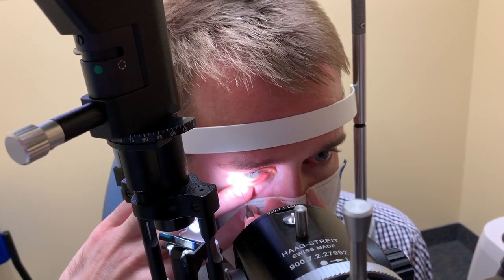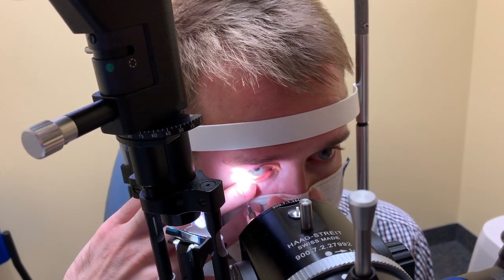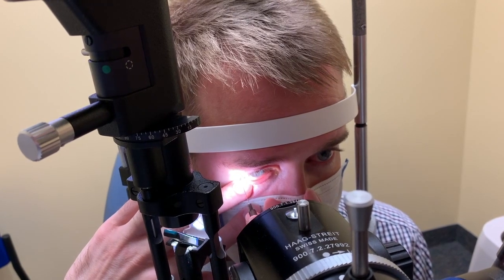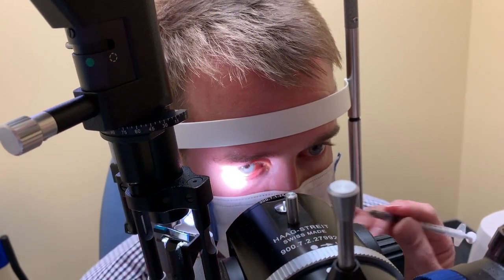There is another way to numb the lids with a lidocaine injection into the lids. I have not had to do this yet, but if a patient is very uncomfortable this can also be done, and this will lead to complete anesthesia of the lid you are dealing with.